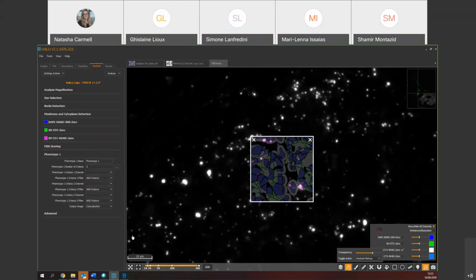And I'll move to the phenotype. So I'll probably set this as double positive as well. All right, double positive, and I set a number of criteria as well. Set this to 2 because I want to consider 2 channels, and I select my first channel, which would be my FITC channel, and the other channel would be the CY3, which is my spot. So here I want the double positive, so I'll select positive in both cases.